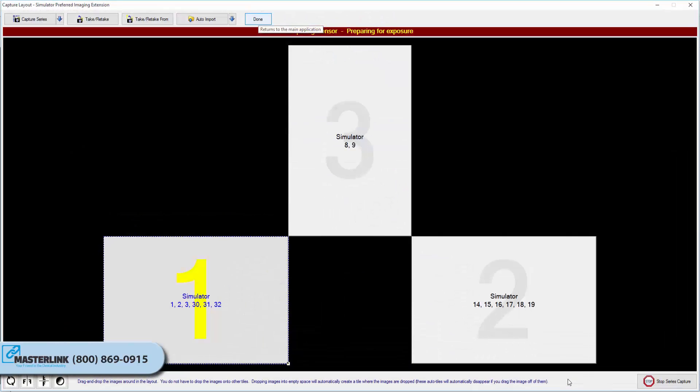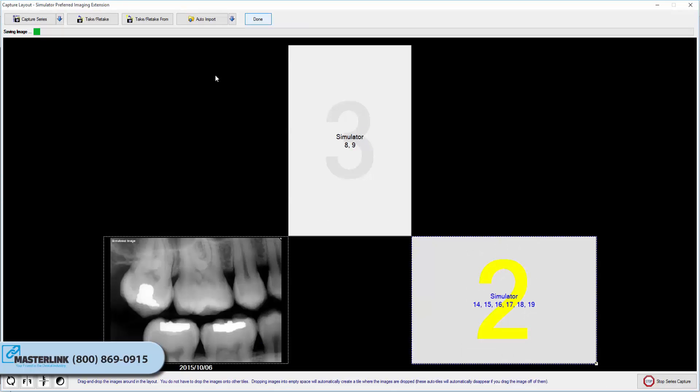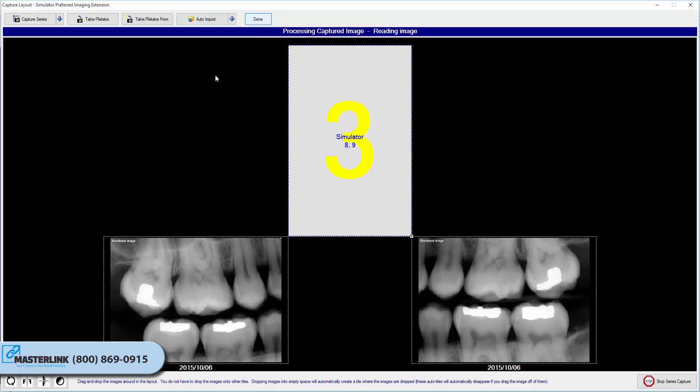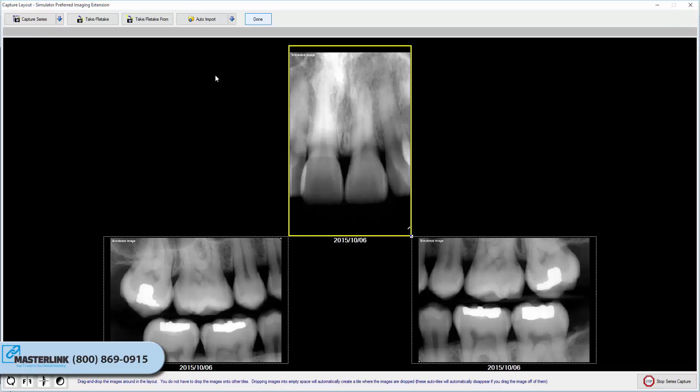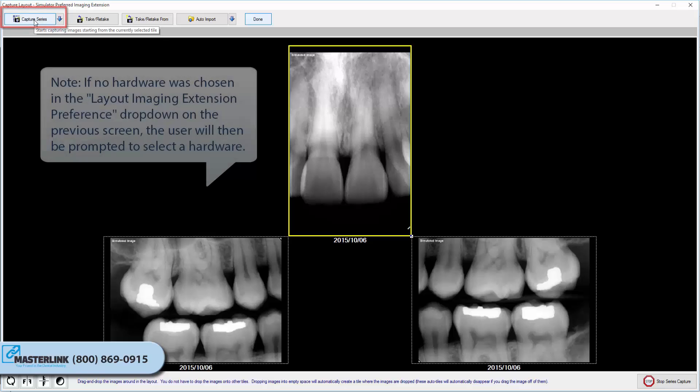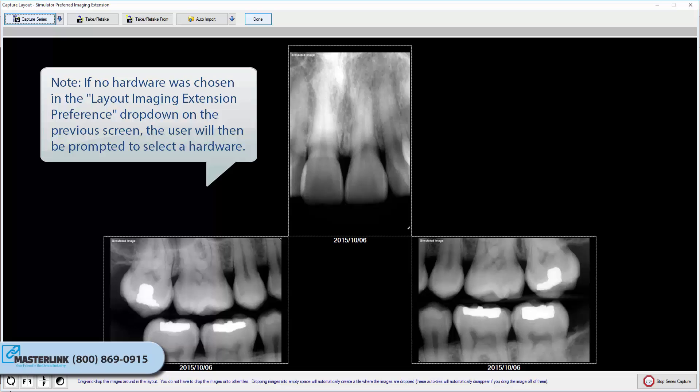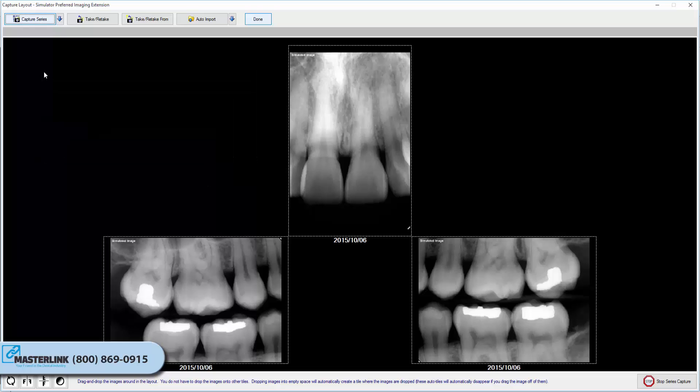Click OK when you have finished adding and manipulating shots in the series. X-Ray Vision will generate a one-time use layout based upon the shots that were selected in the previous window. To begin capturing images, click the Capture Series button in the upper left corner of the window. If no hardware was chosen in the Layout Imaging Extension Preference drop-down on the previous screen, the user will then be prompted to select a hardware. Once you have completed the layout capture, click the Done button at the top of the window.